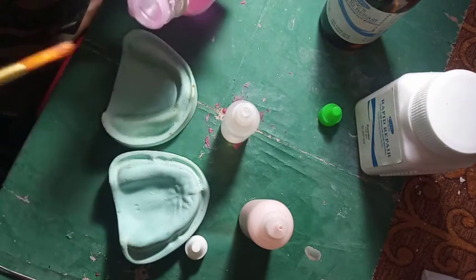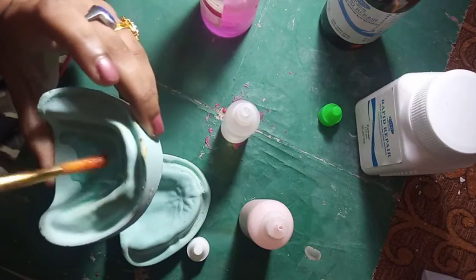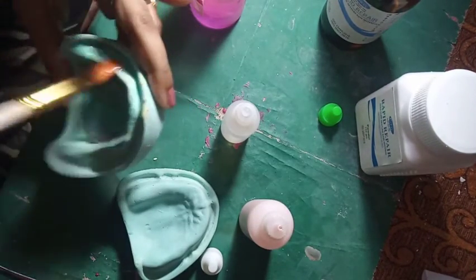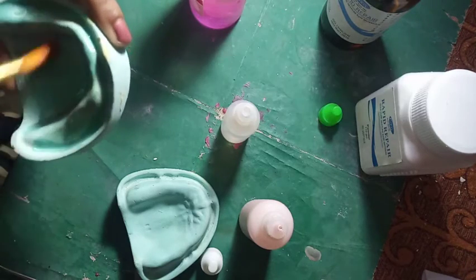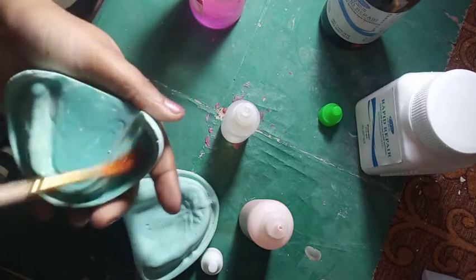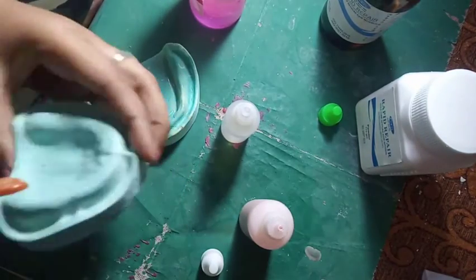So here we are using cold mold seal to apply it on the cast. We need to apply it properly so that it can separate easily. Same process on the maxilla.